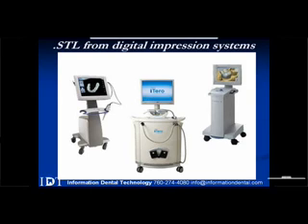Another type of STL is from digital impression systems, like the iTero or COS. If you have a digital impression machine or system in your office, you just request it, and I've talked to some of the companies, and they're pretty good at releasing the STL files. If you send us over the STL file, we are able to work with that as well in Blue Sky.